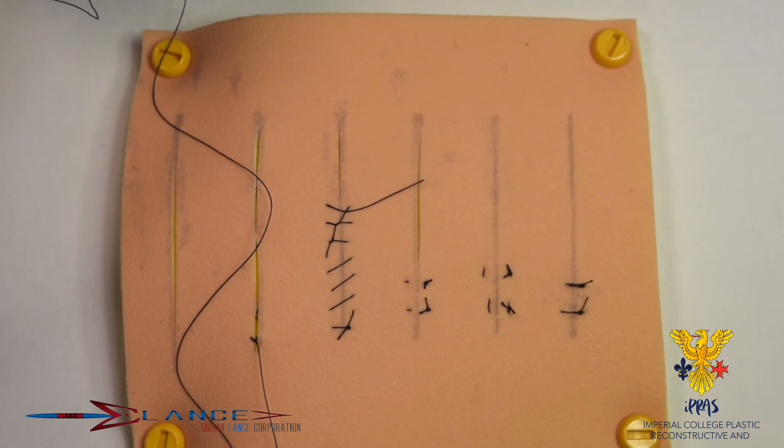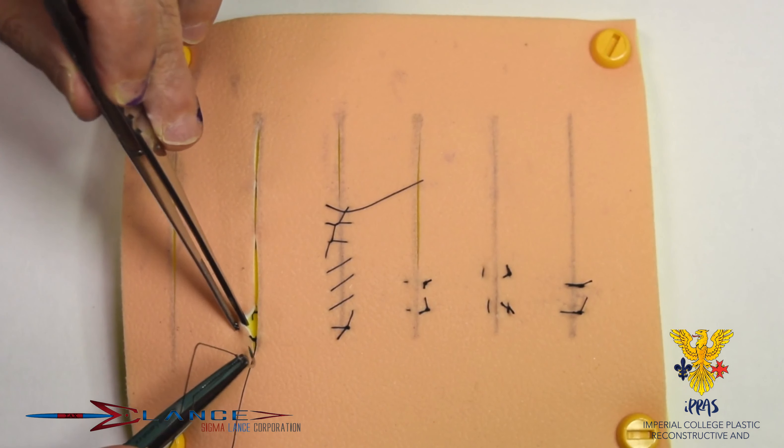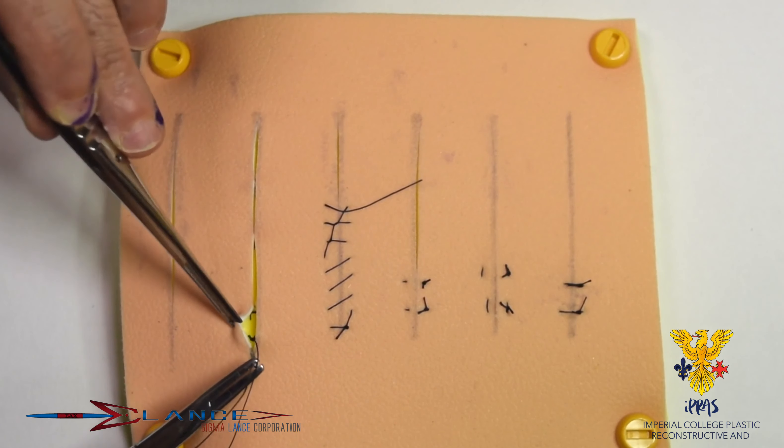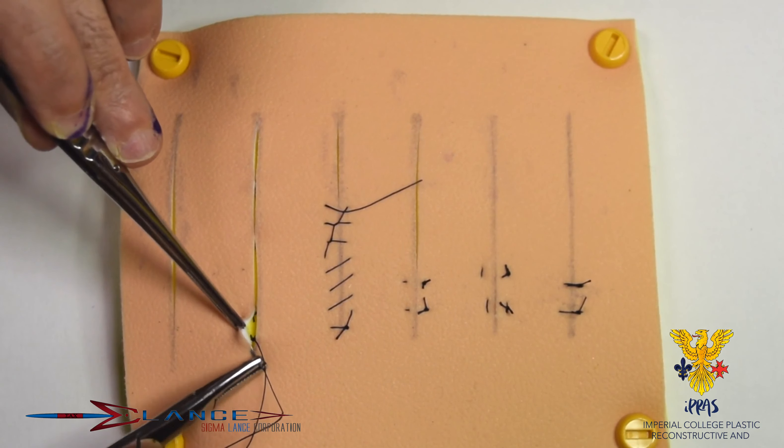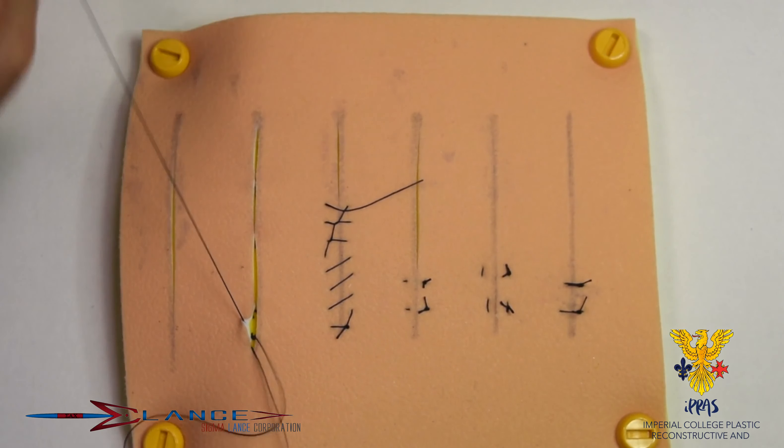And the suture then will proceed essentially in a horizontal mattress fashion, and they have to be squares. So you grab, you must stay in this dermal layer, which is this white layer shown beautifully on this model, and essentially pull through.